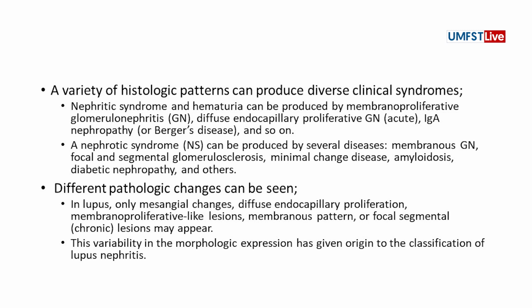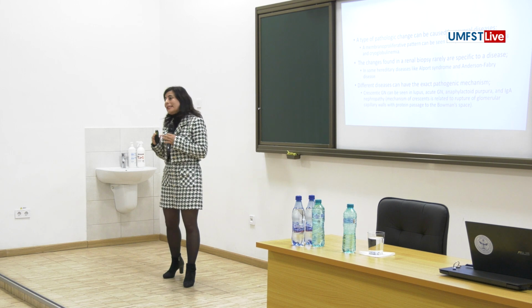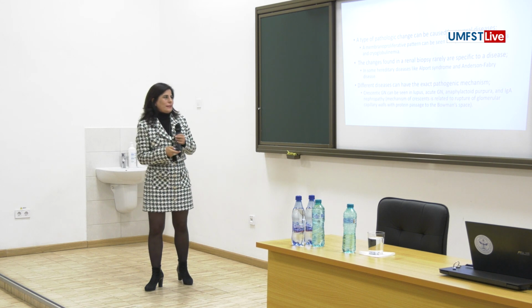The important point in kidney biopsies, we usually give a pattern. We have to make a correlation to the clinic. Some clinical pathologies have the same pattern in kidney biopsies. That's why we also need ancillary tests. Although we have ancillary tests, we still need the serology of the patient when we diagnose kidney biopsies.